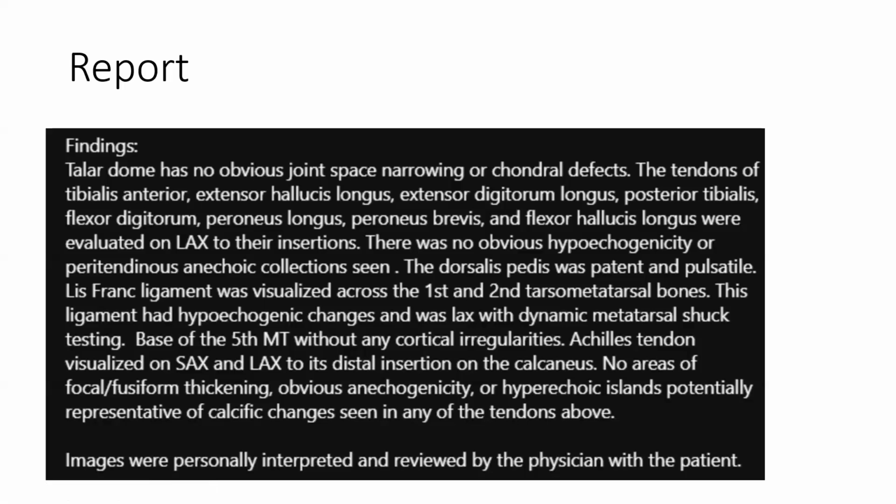And then once we get into that tarsometatarsal area, there's obviously ligaments for each of the metatarsals in that area, as well as intermetatarsal ligaments as well, that could be injured. But obviously, for each of those, I think trying to correlate that with your clinical examination and exactly where the patient is having pain can be helpful, because otherwise this can be an area where you can start to get pretty extensive with your protocol. And so I think just making sure, once again, focusing it with your clinical examination can be really helpful. Those are some of the comments I wanted to make, but we'll open up for any other comments or questions from anyone else.